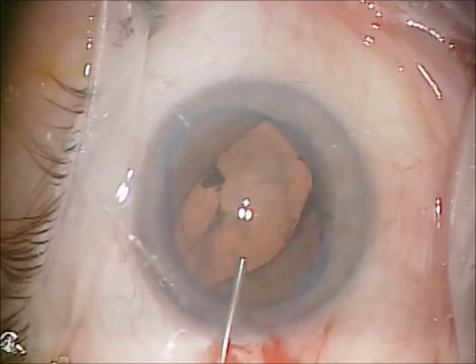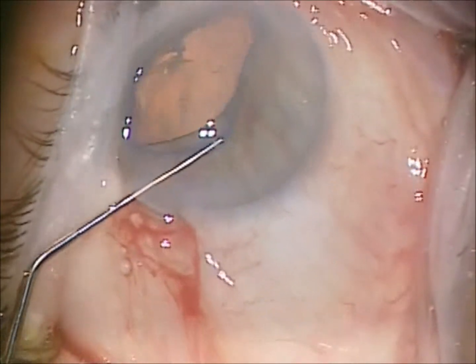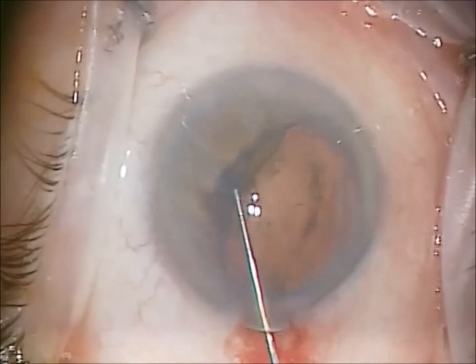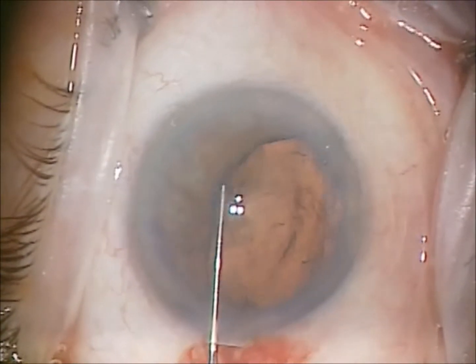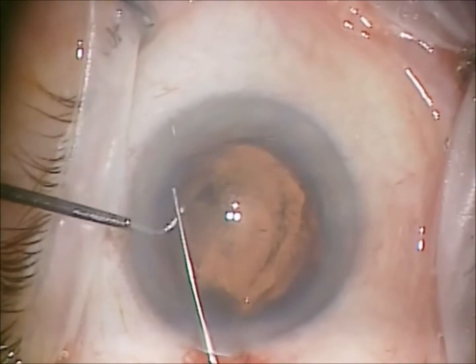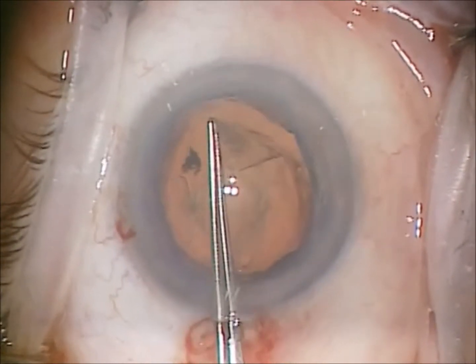As I noticed some shallowing, more viscoelastic is instilled. One more corner to engage. Use a corner wand to help disengage the insertion device, and now under viscoelastic I have a nice big pupil to be able to perform a circular tear capsulotomy.